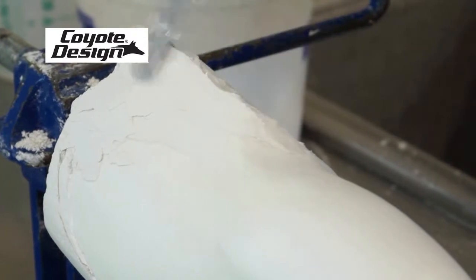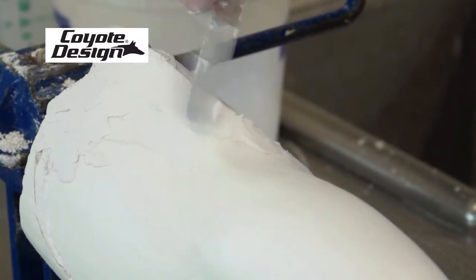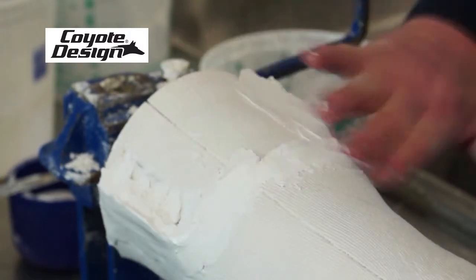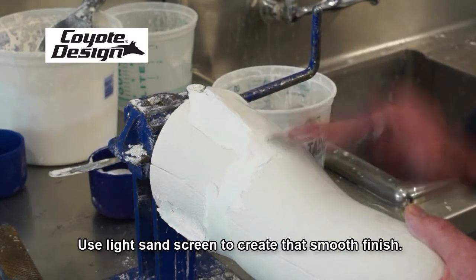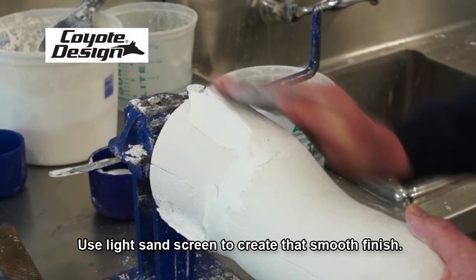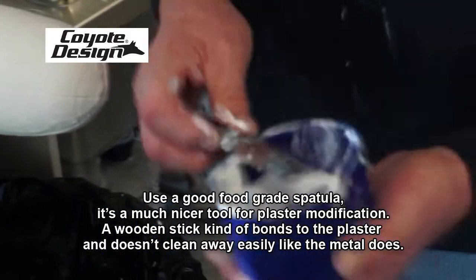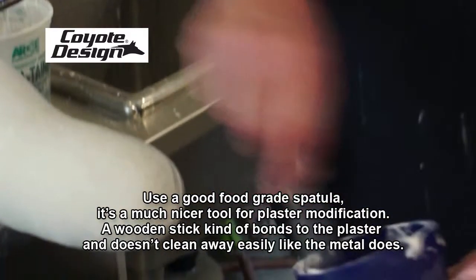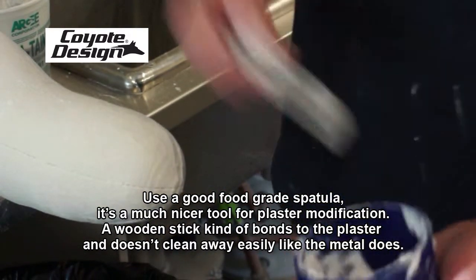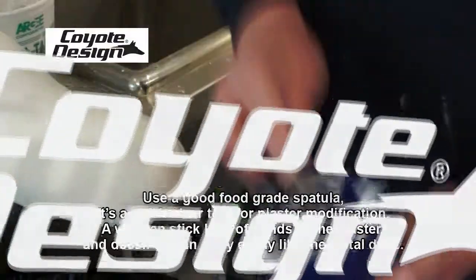Having these two plaster mixes fairly similar in makeup speeds up the whole modification process. It can be smoothed by hand while it's fresh, and as it continues to cure and set up firmer, just use light sand screen to create a smooth finish. Another part of this technique that makes a real difference is using a good food grade spatula — a wooden stick bonds to the plaster and doesn't clean away easily like metal does, making it a much nicer tool for plaster modification.